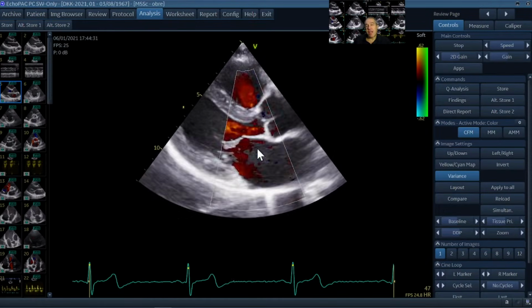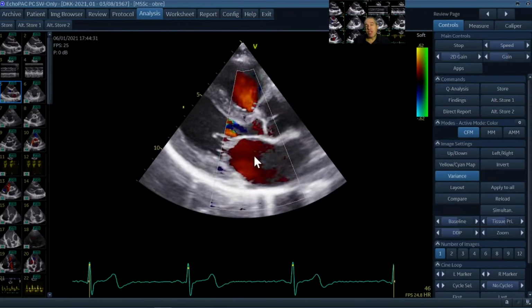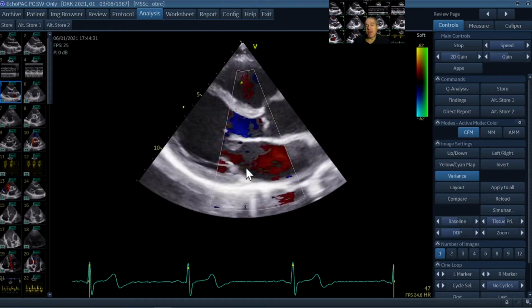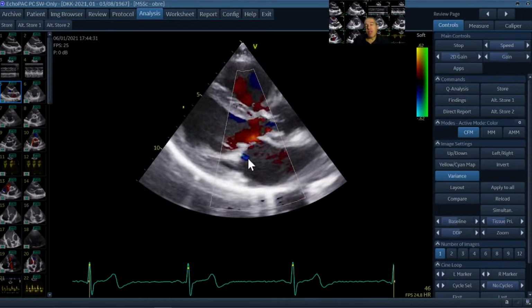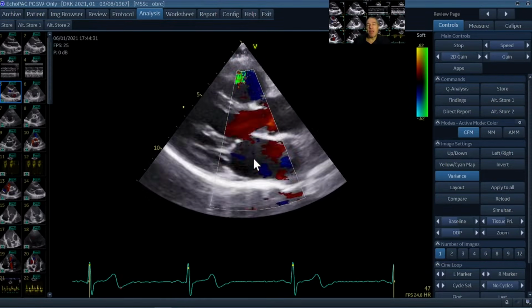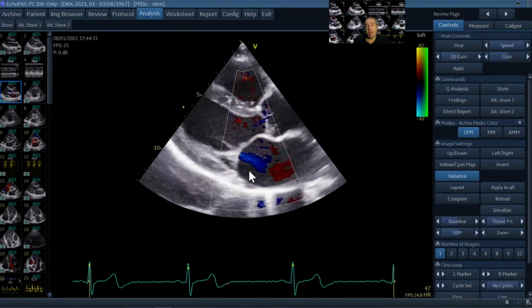So you might think that it's not useful to do the color Doppler, but you want to look for valvular regurgitations mainly, which create turbulence of flow, and turbulence of flow can also be well visualized in that direction here. And you might notice there is a very small amount of turbulence here at some time in one cycle in the mitral valve, so it's a very tiny trace mitral regurgitation which can be picked up here. But in general, this looks pretty normal. There is no regurgitation jet across the aortic valve, and a very tiny one for the mitral valve.